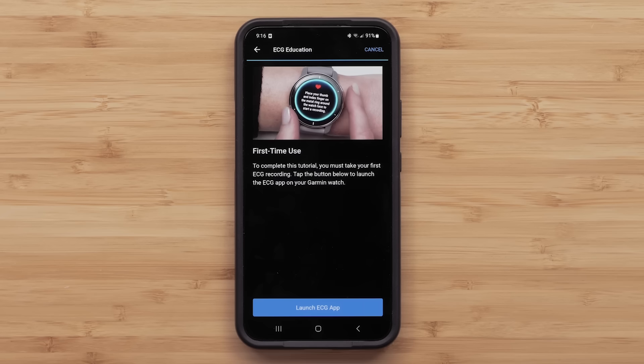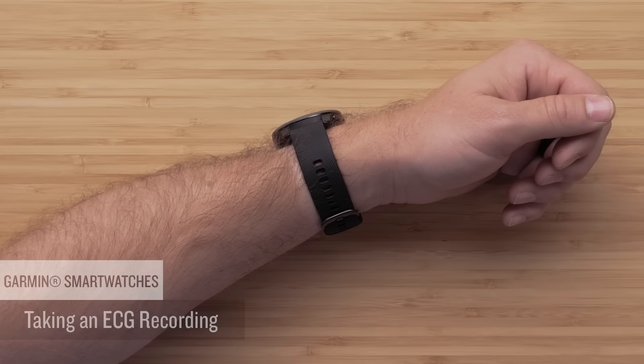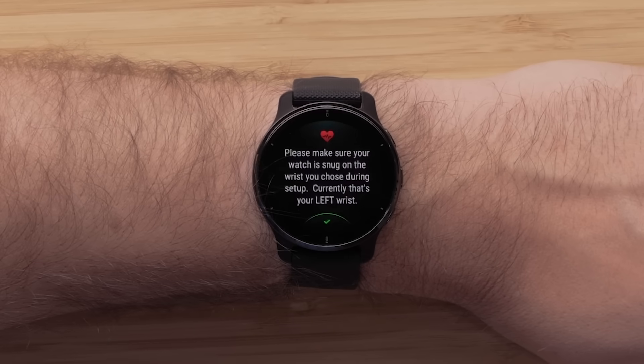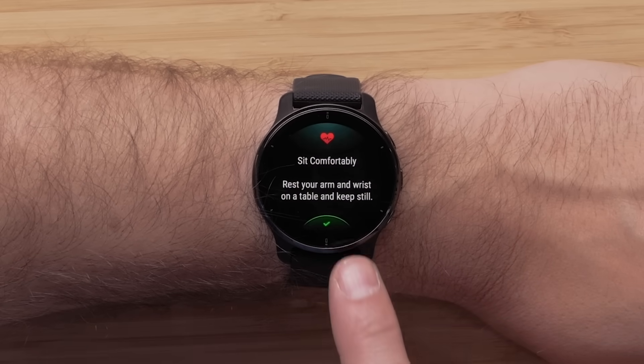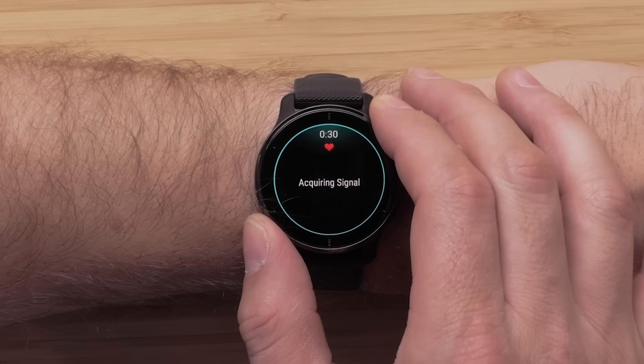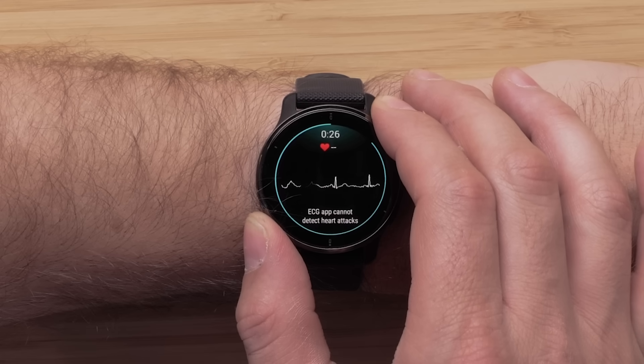At the end of the tutorial, you'll be prompted to take your first ECG recording. Follow the on-screen instructions. Make sure you're wearing the watch snugly on your wrist, just above the wrist bone. Now rest your arm and wrist on a table. Place your thumb and index finger on the metal ring around the watch face. Remain still and keep your fingers in place for the entire 30-second recording.